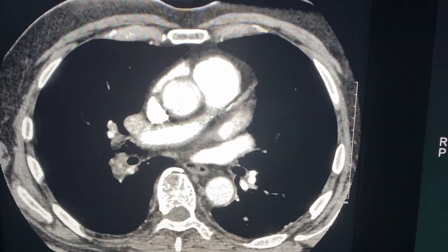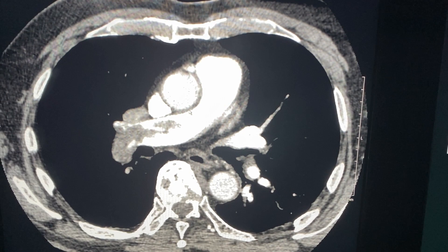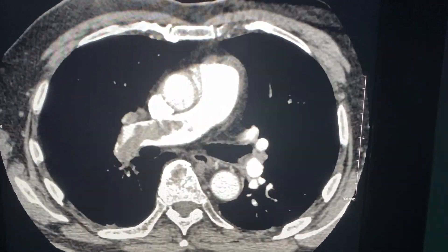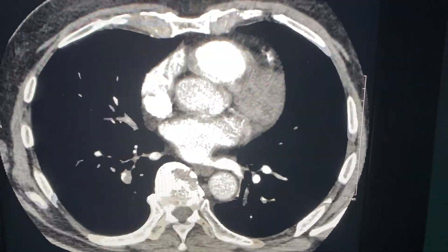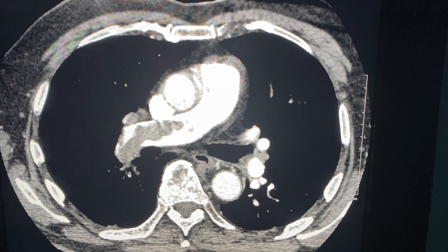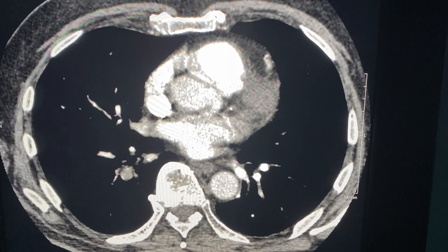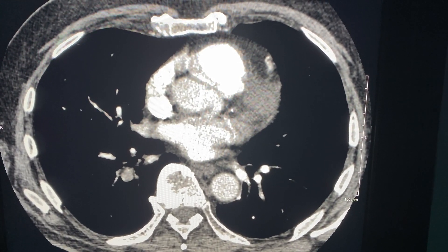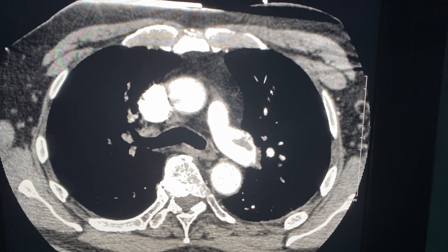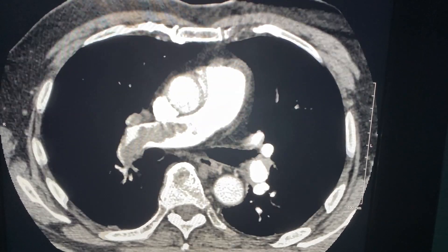Right here, if you take a look, all this bright signal you're seeing in the chambers of the heart is because contrast was given via a vein. The contrast was given into the blood, and that's what gives it this bright attenuation on CT. As we follow this vessel, we see it pumping into the lungs — and we see this big glob here. If you follow it, the glob extends further into additional branches. And if we look on the other side — remember there are two main pulmonary arteries — we take a look at the left side and also see some dark signal there.